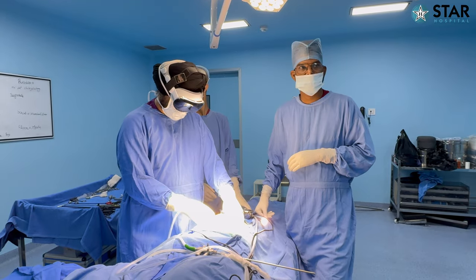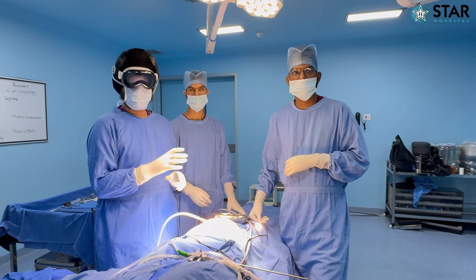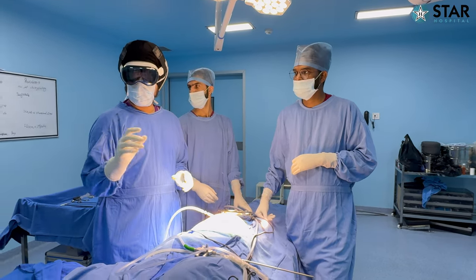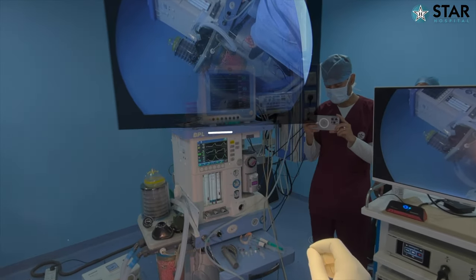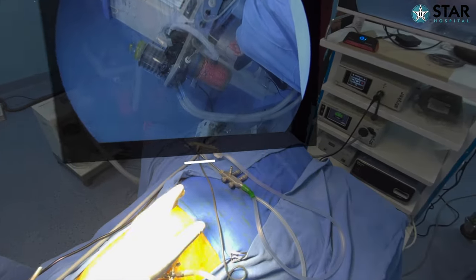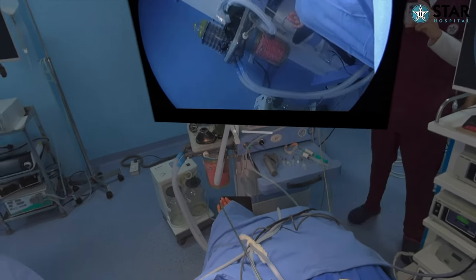We can see the organs, the instruments, the distance, and everything else. My assistants can view the monitor that is right in front of them, and I can use my monitor and place it anywhere — away from me, close to me, or on the patient's downside — as I keep changing position for various parts of the surgery.